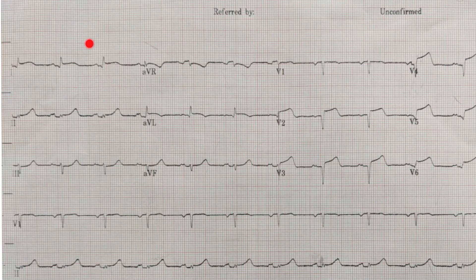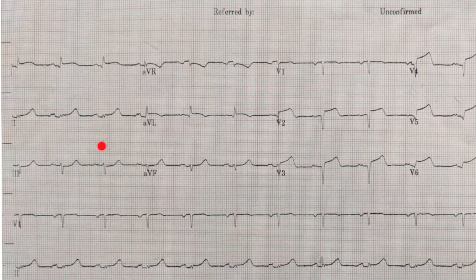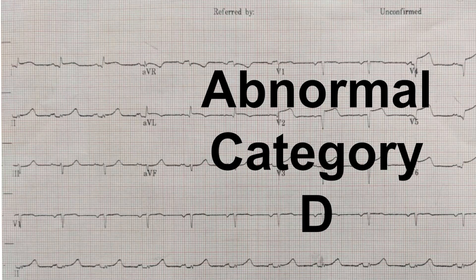Looking at the highlighted leads, there is clear ST elevation compared to the baseline — whether TP or PR — visible in V2, V3, V4, V5, and V6. There is ST elevation involving anterolateral leads, and reciprocal changes between AVL and lead 3. This is a Category D EKG — abnormal and requiring immediate emergent intervention. This is a STEMI, or occlusion myocardial infarction. Remember: T-wave amplitude is always relative to the QRS, and always compare ST to a known baseline segment.